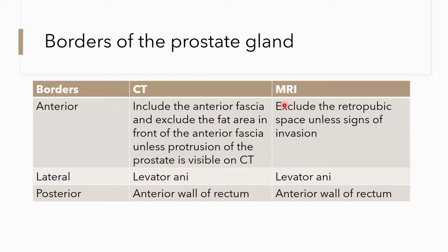Similarly, if we are using MRI, now how many of us use MRI? I think that a proper MRI fused prostate cancer radiotherapy is generally rarely done. And to my mind, it's not really that important unless we want to give radiotherapy with very small margin. In our practice at Tata Medical Center, we usually look at the MRI, but we don't fuse the MRI with the CT.